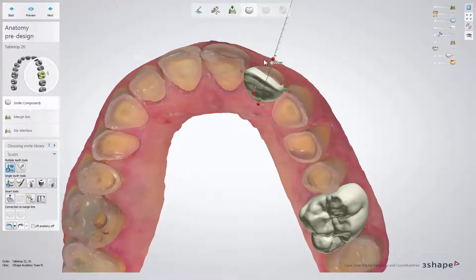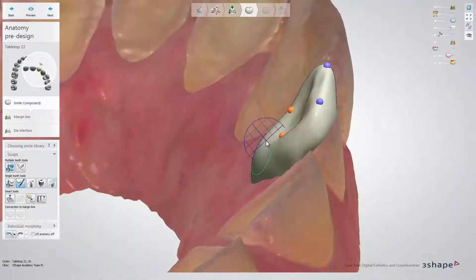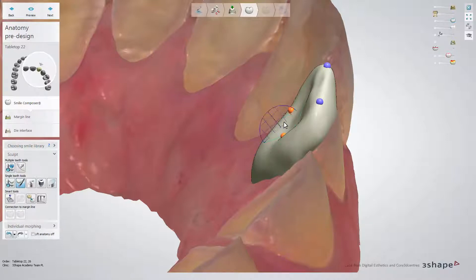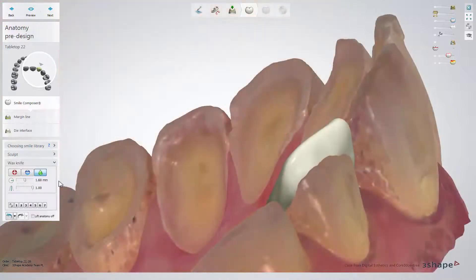Placing the anatomy first helps you to fit your design to the unprepared teeth to obtain a highly aesthetic design. All of the Smile Composer toolkit is available to help you to obtain the desired anatomy.